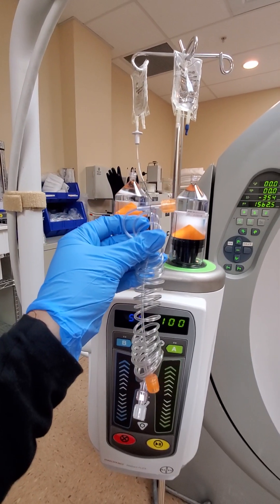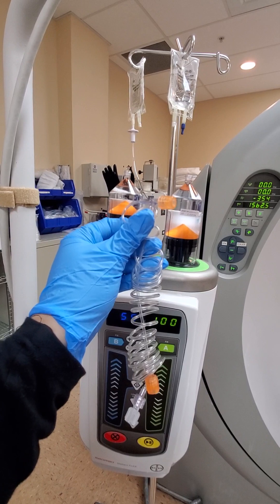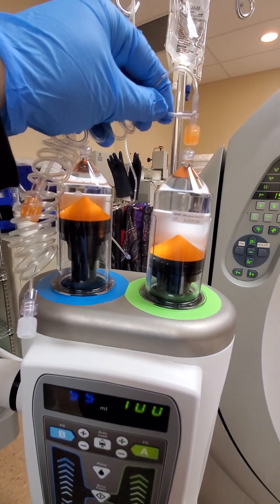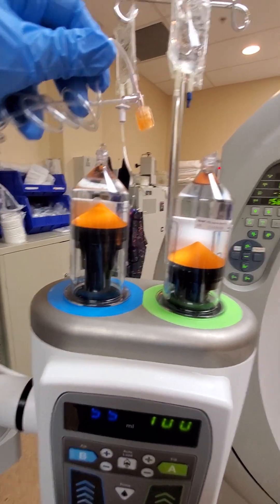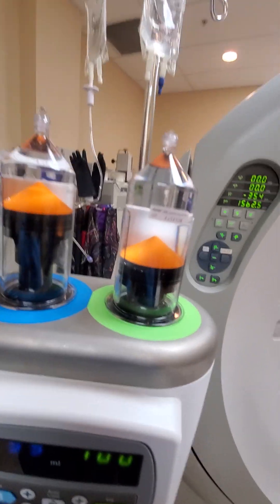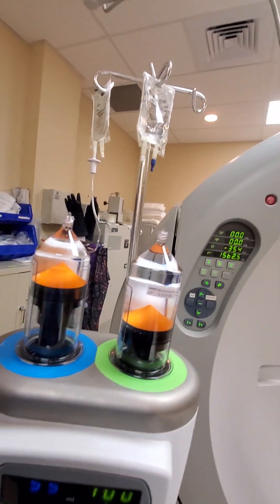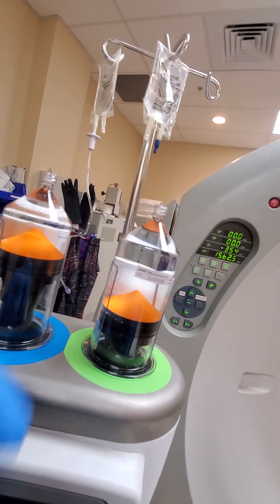Now we're gonna attach the tubing that the patient will be getting the contrast and saline through. The short stub is for the contrast and the longer one is always — always — for saline. So contrast first.